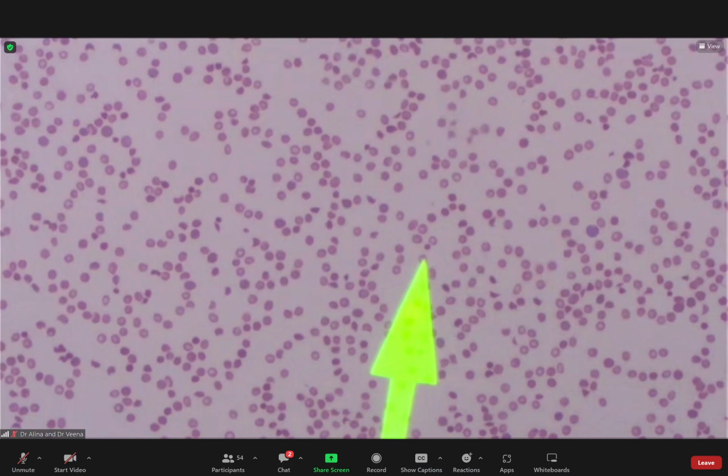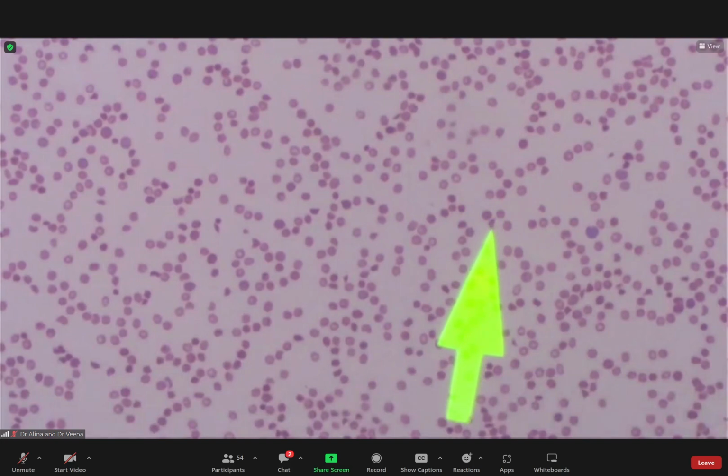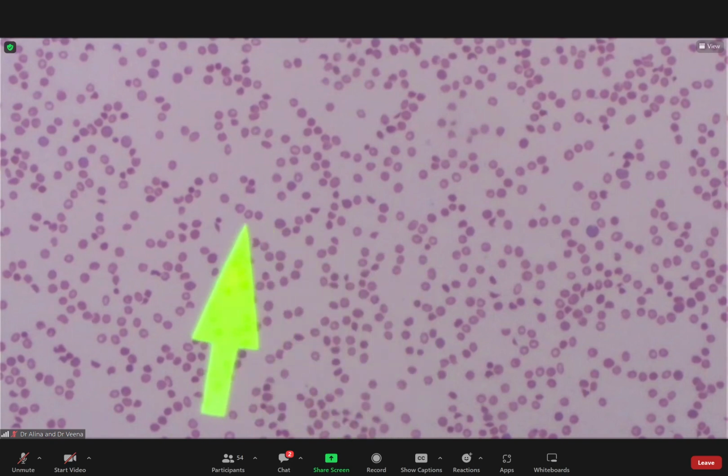Physician. Okay, so if you've never seen MAHA, this is what MAHA looks like. This is a typical MAHA picture. Polychromasia, fragmented cells. You see these cells that don't look like red blood cells anymore. And spherocytes and microspherocytes. The microspherocytes are those little tiny round cells that have no central pallor. And a background of thrombocytopenia. So this is typically MAHA. Any questions? Okay.